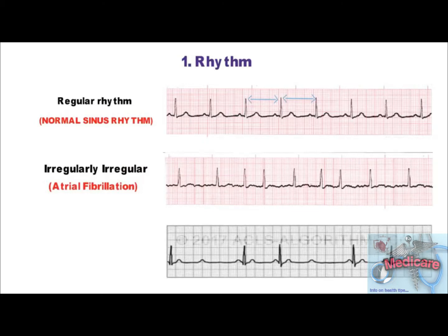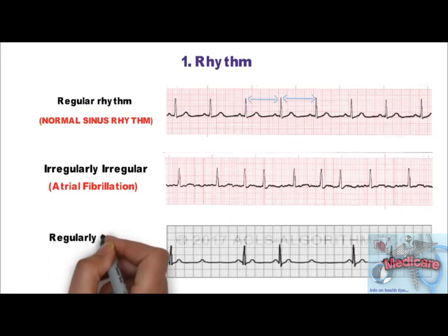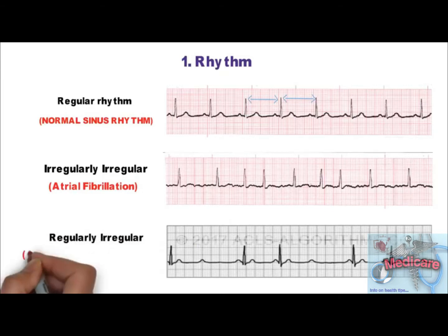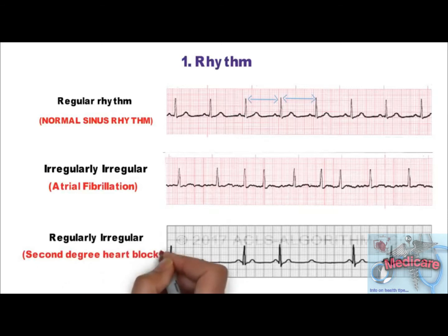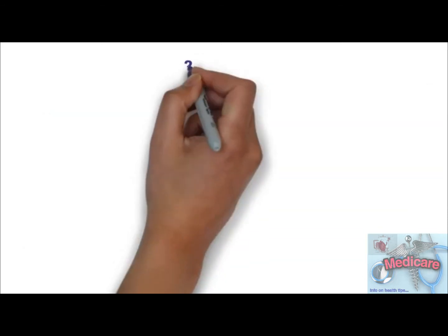Now look at this ECG: normal regular rate with a regular dropped beat. So the rhythm is regularly irregular, which is seen most commonly in second degree heart block type 2.